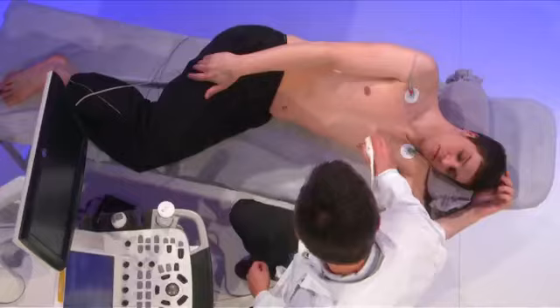So this second case is the case of a patient presenting mitral valve disease, mainly with stenotic mitral valve and some degree of aortic regurgitation. And I think that this case also will help us to emphasize the features which are important to be taken into account in this complex situation.